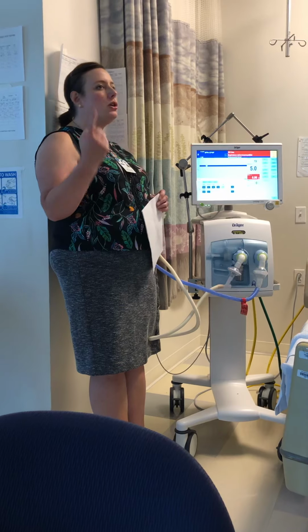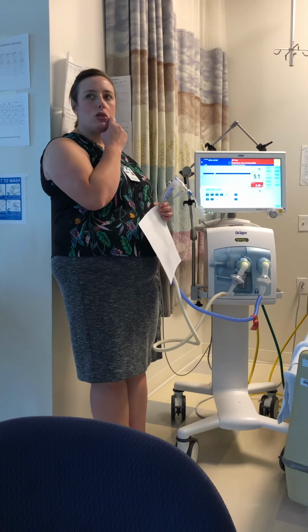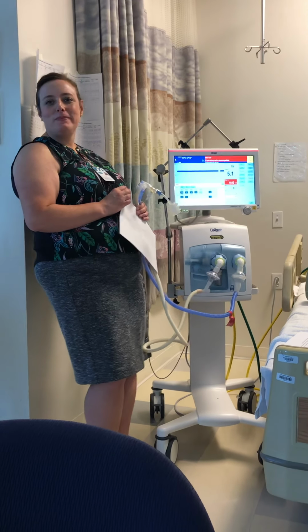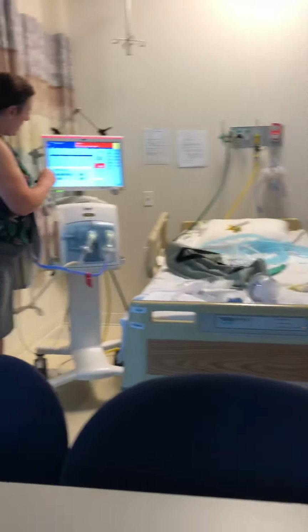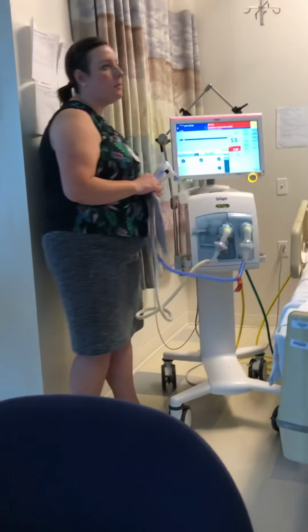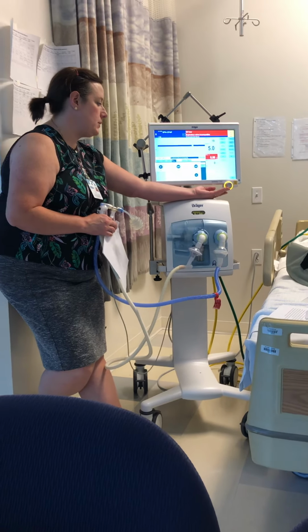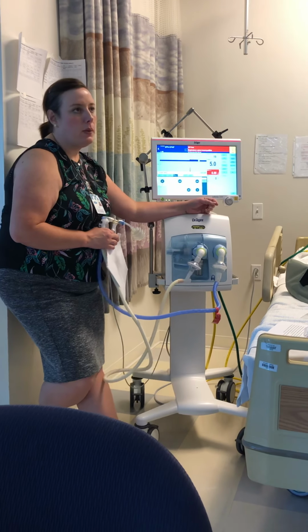What if they still have an increased work of breathing even after we put them on, say, 5 of non-invasive? What do you think we should do? They're still retracting, they still have nasal flaring. Crank it up some more. Okay, crank what up? You increase the pressure support? There's no pressure support. So we would change the amount of PEEP, right? Adults, you'd probably go from 5 to 7 or 10 even. For kids, especially neonates, we'd only go to like 6. We'd only increase by 1 and reevaluate.